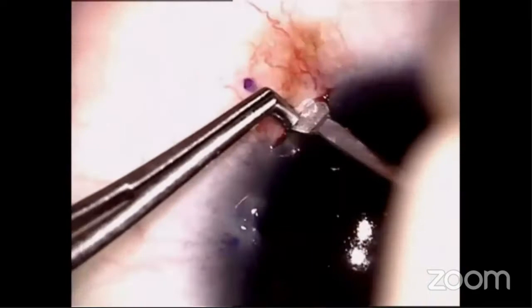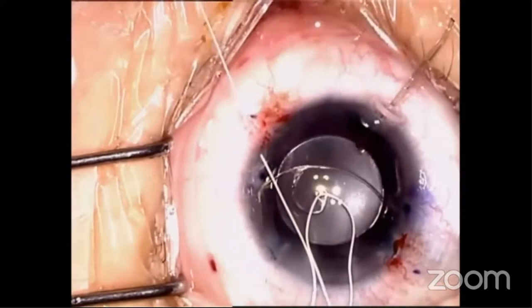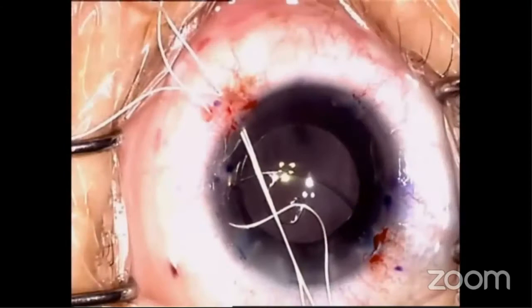After inserting the toric lens and adjusting the alignment, we remove the viscoelastic from under the lens and then refill the anterior chamber, and we mark 1.75 mm posterior to the limbus and create the Hoffman pocket at least half scleral thickness deep. Now we create the suture snare with a 26 gauge needle threaded with a Gore-Tex 7-0, which is called CV8. We use the suture snare, come under the iris remnant, extend a loop of suture to lasso the end of the suture loaded onto the capsular tension segment to the scleral fixation point, and we repeat this maneuver for the other end of the suture.